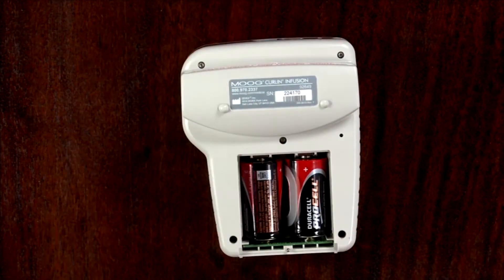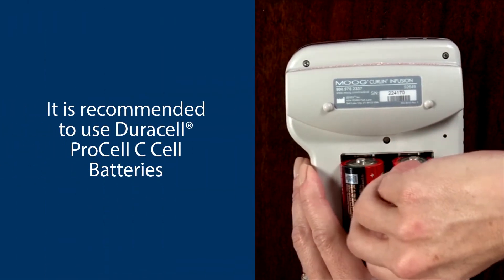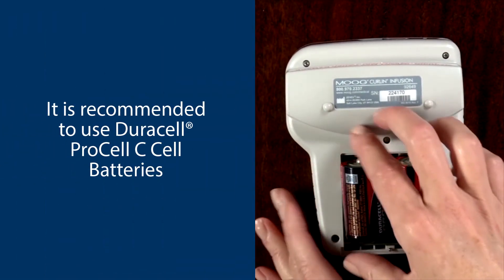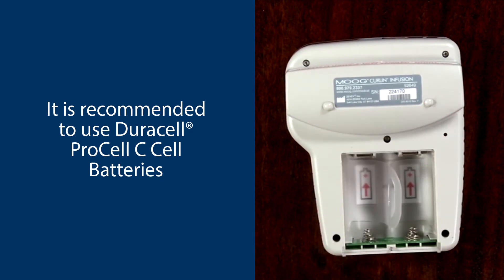Remove the batteries. If your pump contains a plastic tab between the batteries, pull up on the tab until the batteries can be removed. Otherwise you may need a penny to help remove them. Use the coin to pry it up and out from the top.